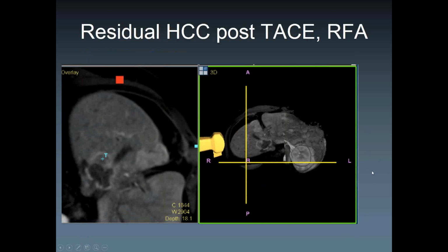This one here is another example where you have MR evidence that after the ablation zone here, you have some local recurrence right there. You mark this as your target, and then you go in with fusion technique again and try to re-ablate this area in here.